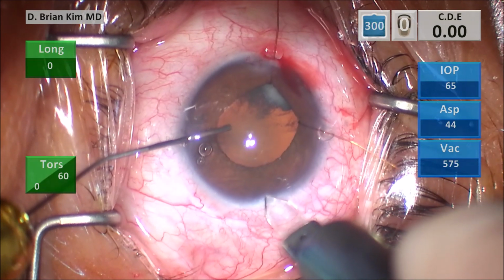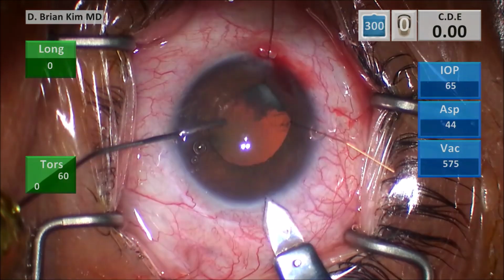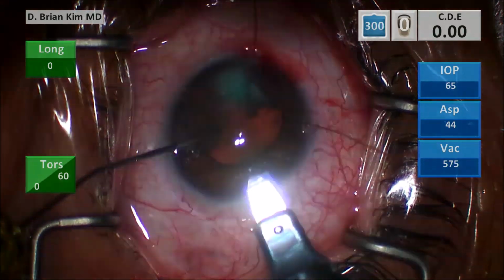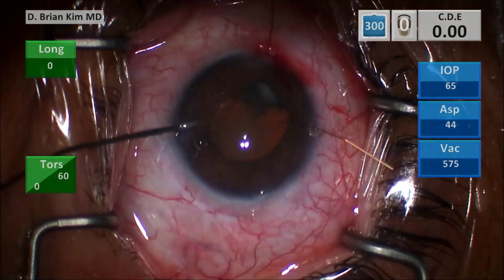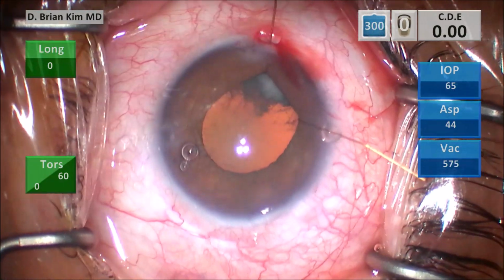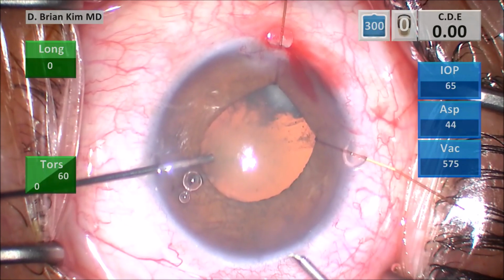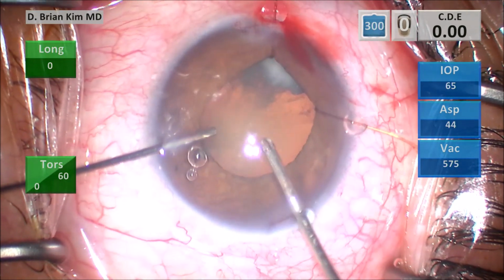The only problem with using trypan blue in this situation, when you have a potential defect to the posterior segment, is that the trypan blue can get into the posterior segment and ruin your red reflex. And that's my triplanar corneal incision that I made. And now this is my capsulorhexis using the microforceps from Moria.